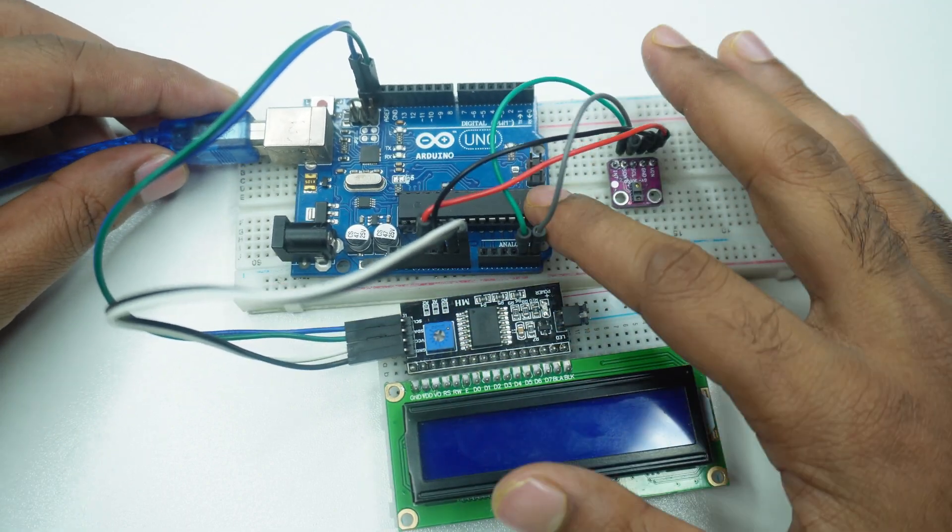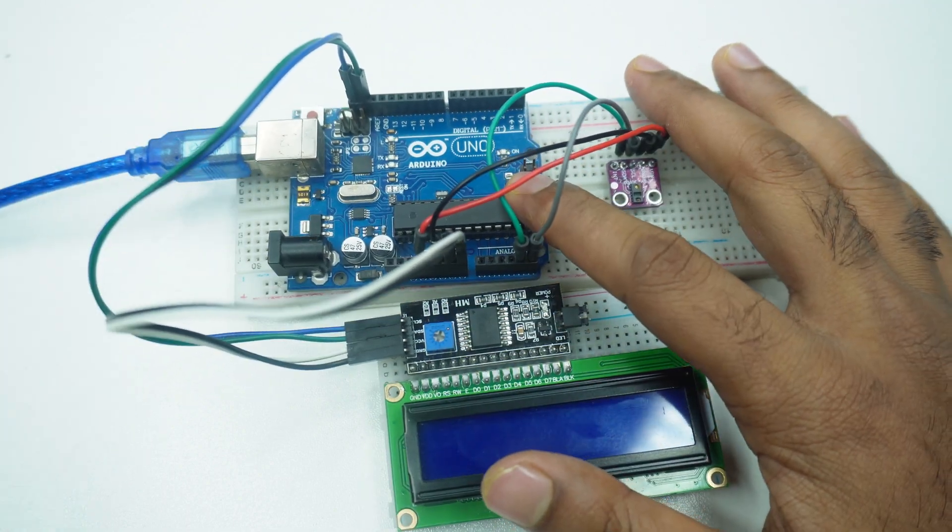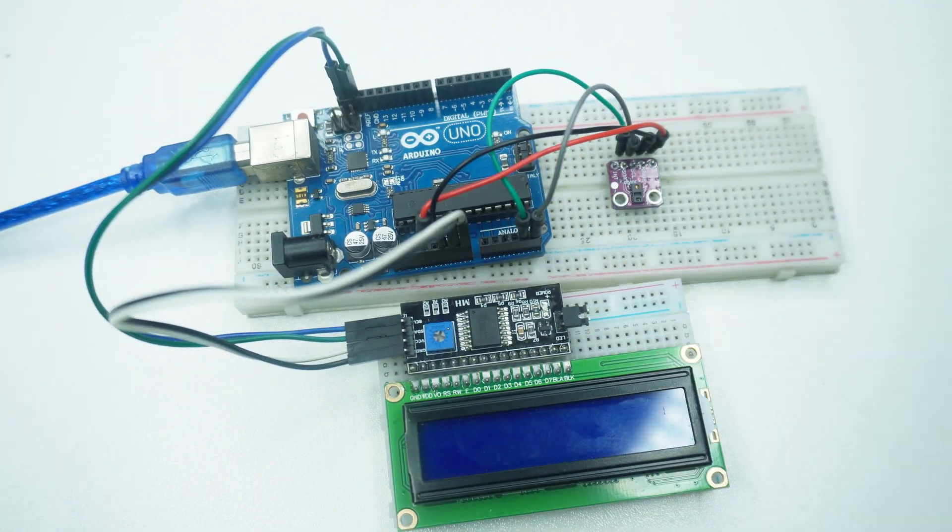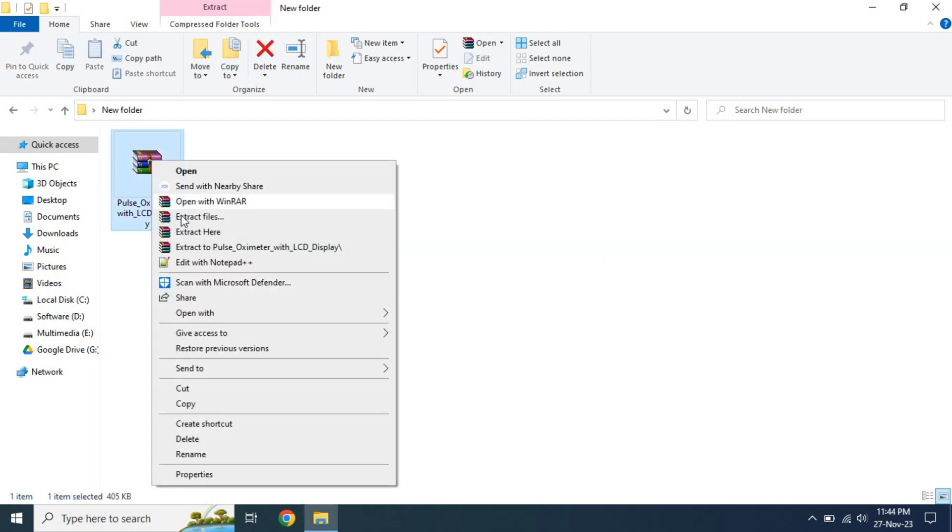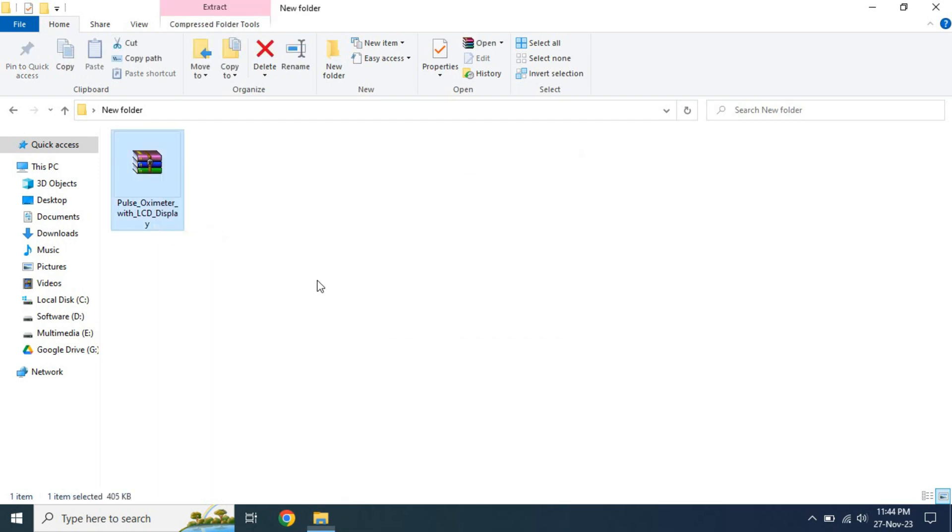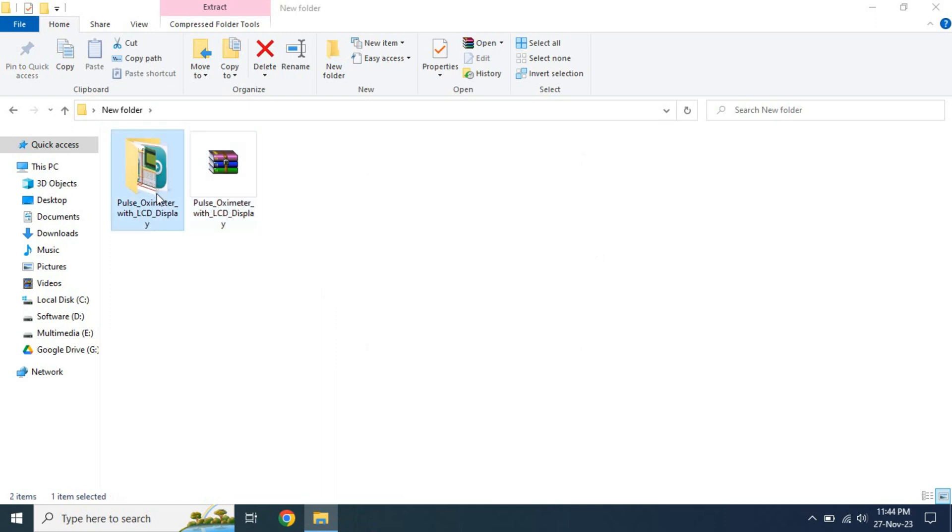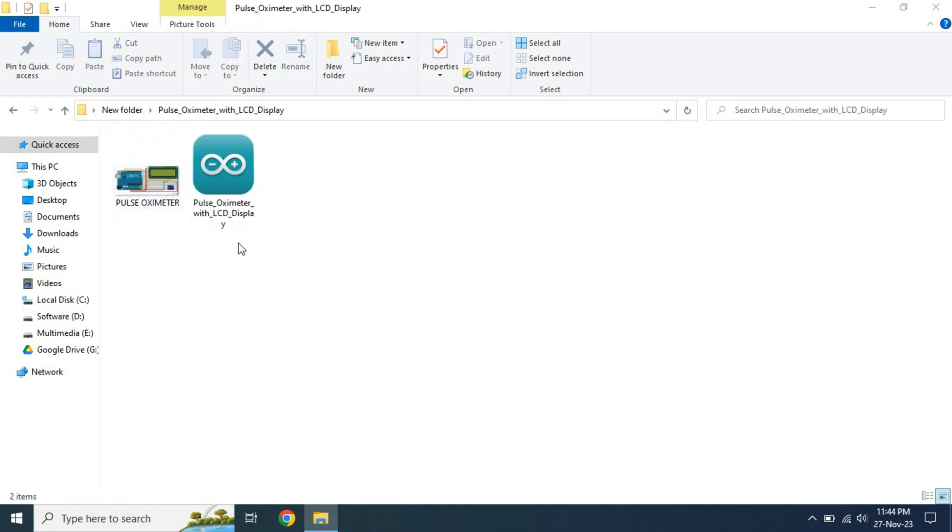Now, it's time to upload the program from our computer. Download the file from the link given in the video description. After unzip, we will get the diagram and program file. Now open the program file in Arduino IDE.